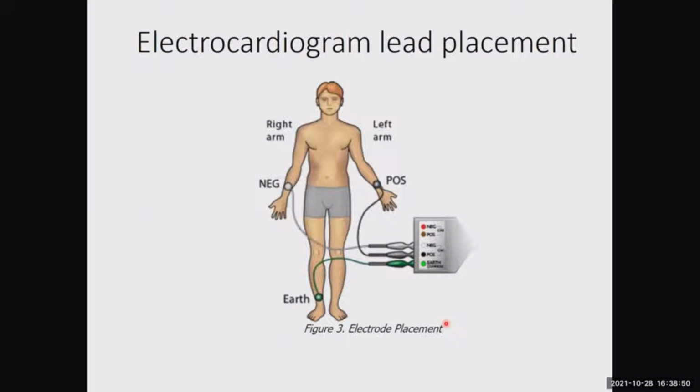Now, in our laboratory setting, we're actually going to be using a modified 4-lead. We're actually going to be using a 3-lead system. And similar to what we did with the EMG lab, the electromyograph lab a few weeks ago, we're going to use an interface attached to the PowerLab system. We're going to have a series of leads that are coming off.